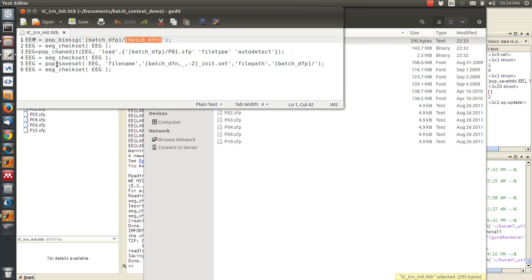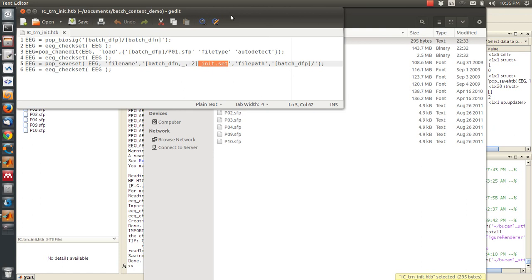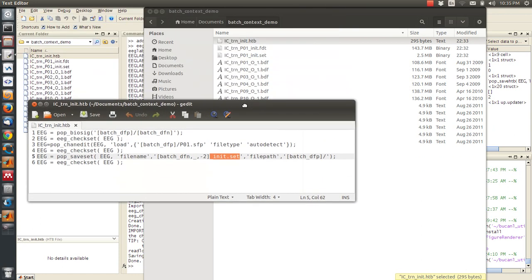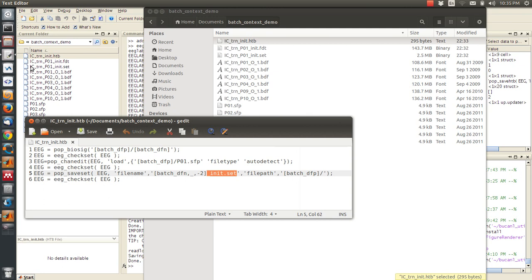At the end of the file, whenever it is saved, you see that it found that the same name was used again, except it was changed. So what this notation means is that it's going to find the same file as the input, except at a specific underscore, that is the second one from the end, instead of writing what it wrote before, it's going to replace it with this. So in this case, I read in ictrnpo1 underscore o underscore one dot bdf. If I go back two underscores, here and then here, and instead replace this trailing part with what is here, I get the output file.